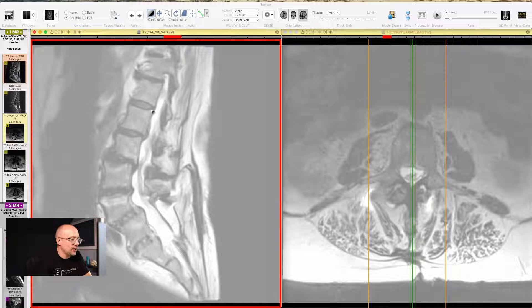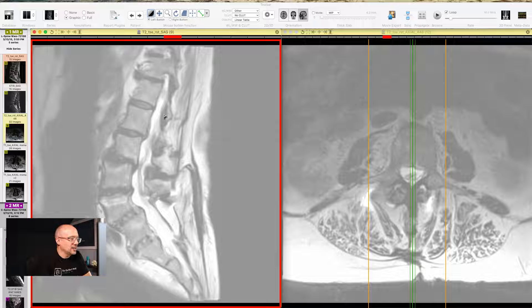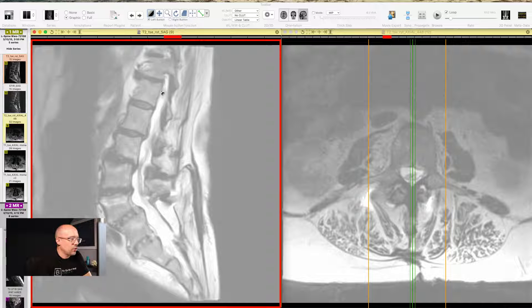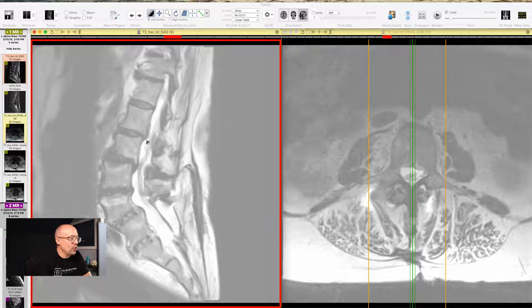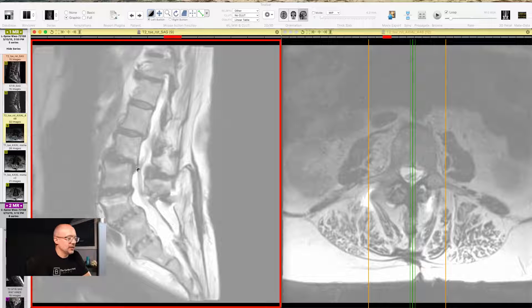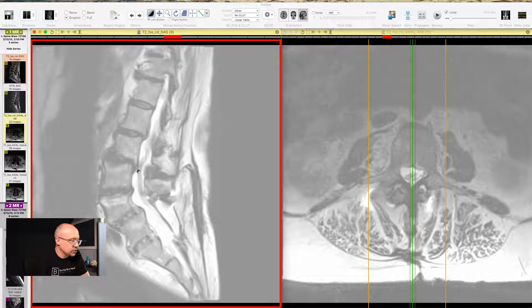That white area going all the way down the posterior or backside of the bones and discs, that is the spinal cord or the spinal canal. And it becomes the cauda equina as we get down towards that lower lumbar. We're looking at a lower low back right here.